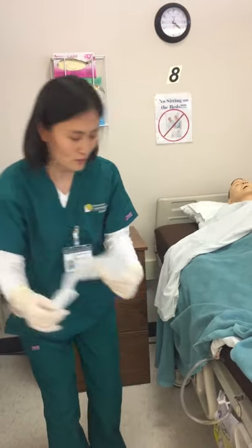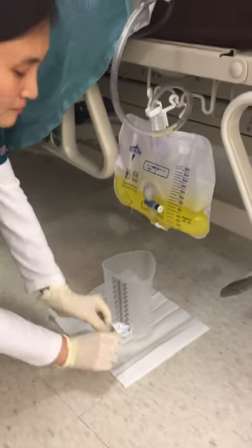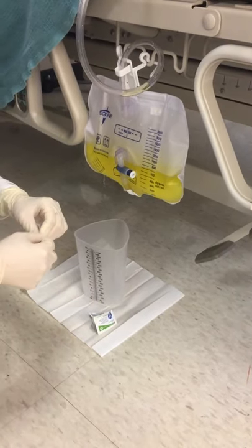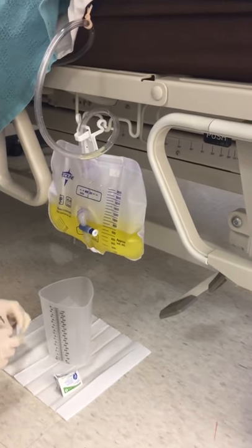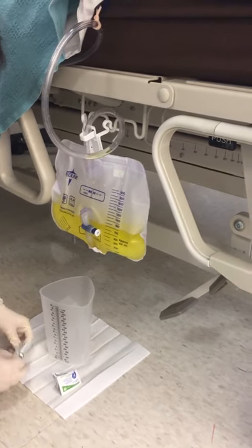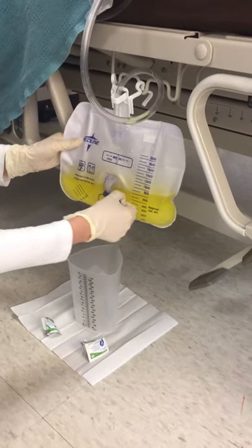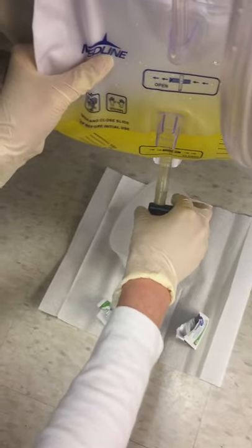Place the paper towel on the floor along with the graduated cylinder and alcohol swabs. Make sure the spigot never touches the graduated cylinder during the whole procedure.